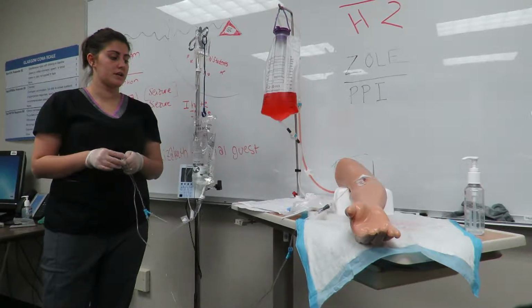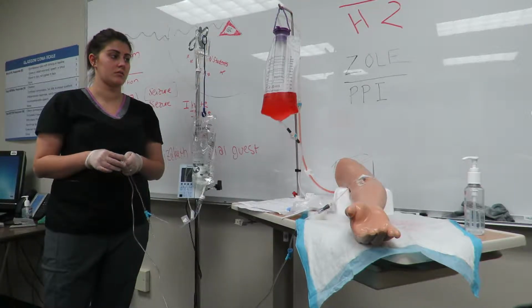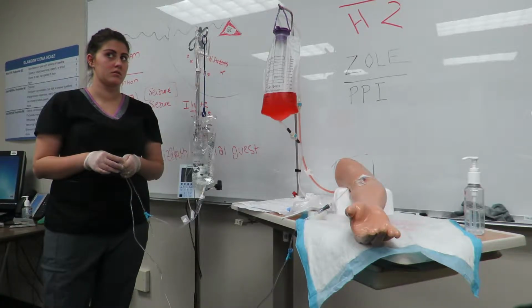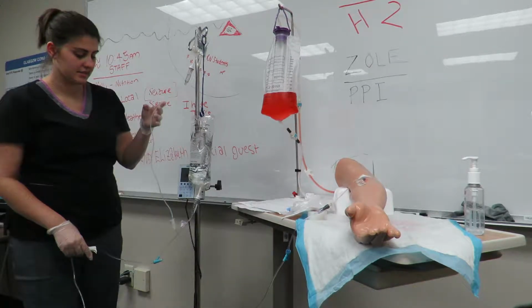I'm going to do 3 drops per 15 seconds. Okay, we're at 3 drops for 15 seconds.